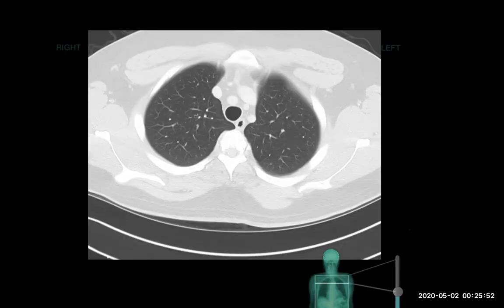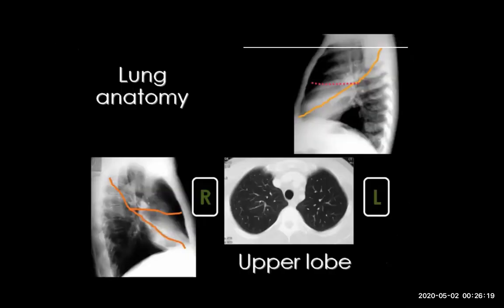The lung window (pulmonary window) is used for assessment of the parenchyma. We assess the air — for example, the bronchi — and any pneumothorax, which appears black just like the trachea. The lung window is essential for assessment of lung diseases, especially interstitial lung disease and deposits. The lung anatomy on CT is just like on X-ray but in 3D. This is the major (oblique) fissure on the right side. This is the minor (transverse) fissure.